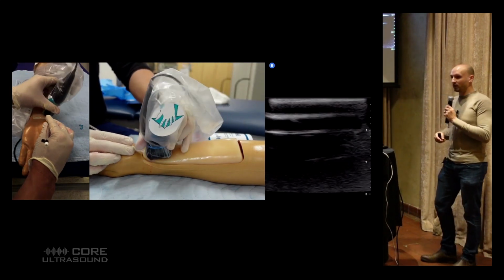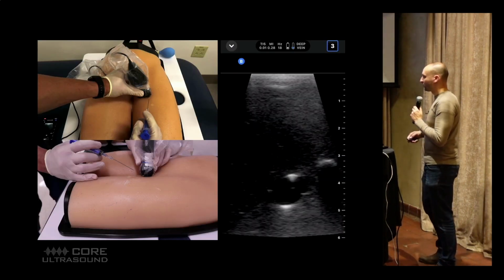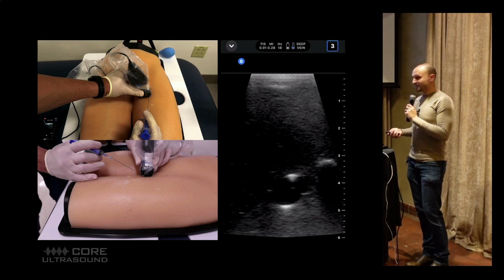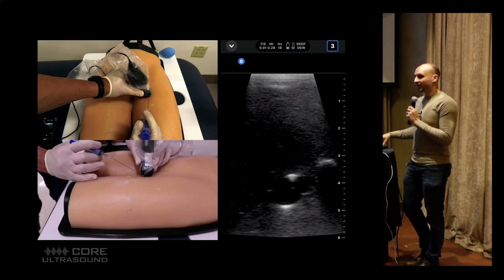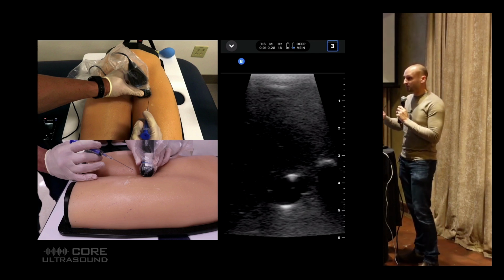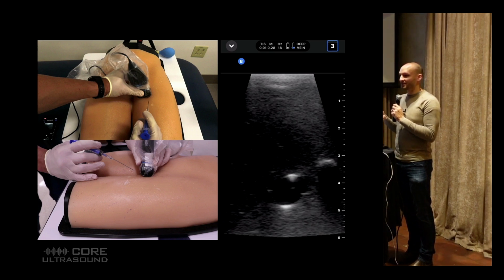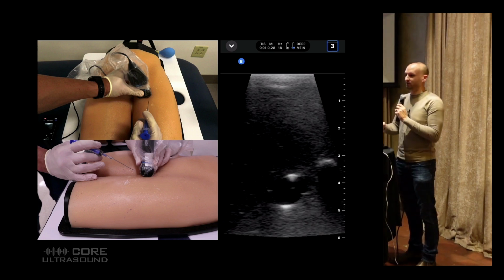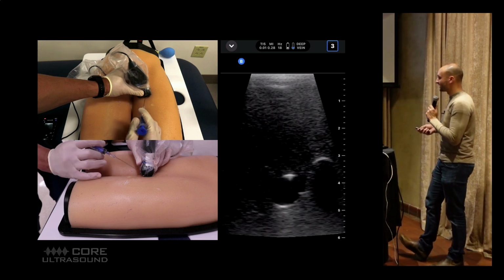This is an example of doing one in the radial artery, but for the most part, I'm actually doing a femoral artery cannulation on my coding patients. And of course, with these central lines, if you're having difficulty with access, do the IO. That's the first thing, right? If you have no IV access, do your IO. But if you need something bigger, throw in that femoral line. It's fun to do crash femoral lines, just like blind. They're fun, but bringing your ultrasound machine in there might take a few extra seconds. If you have a handheld machine, you can use the handheld machine so it's not in the way. And this actually overall, I think, decreases the amount of time that it takes me to get those cannulations, even if I have to bring the ultrasound machine in the room, because I'm much faster with the ultrasound. So I'm usually using ultrasound for my femoral lines.